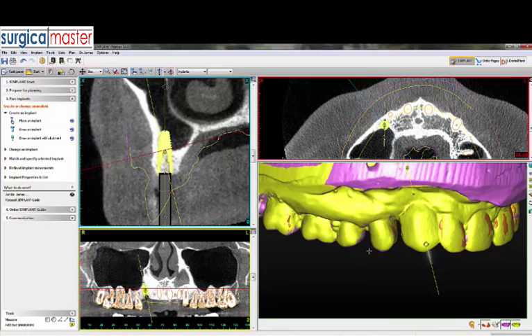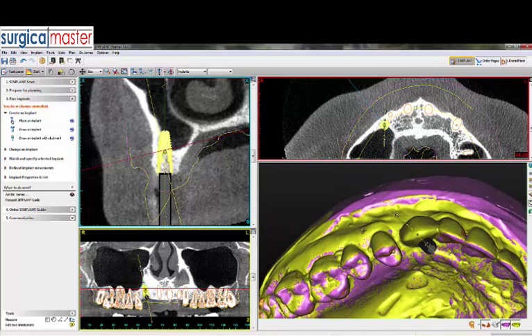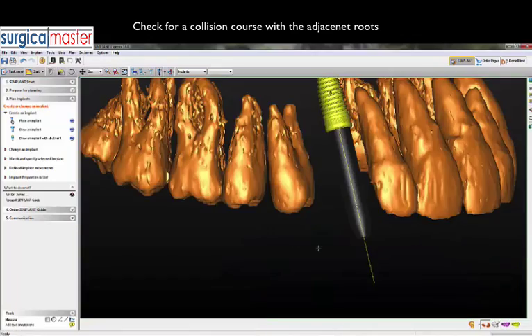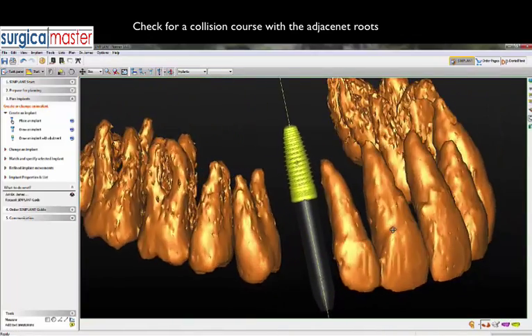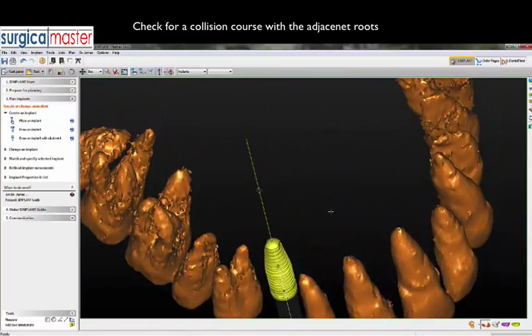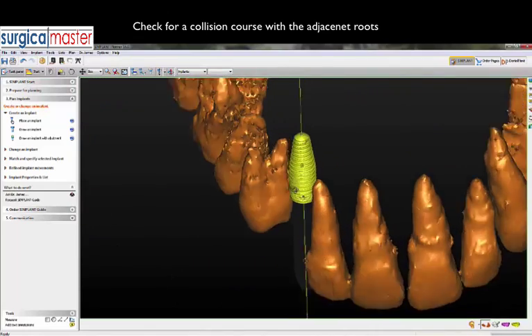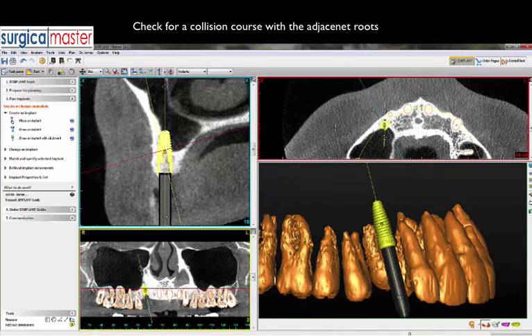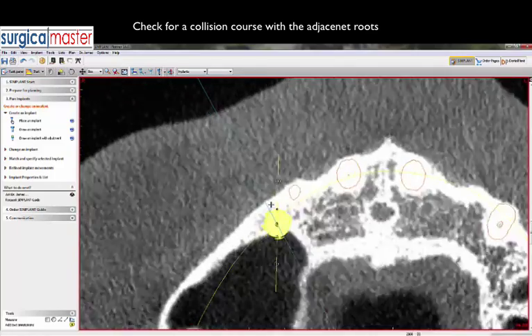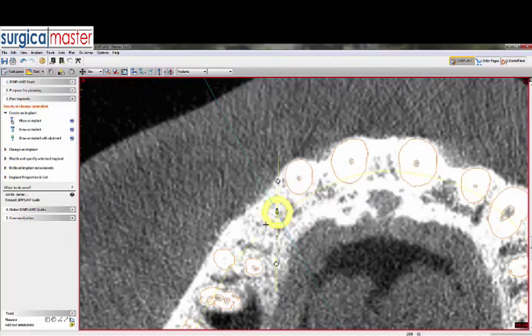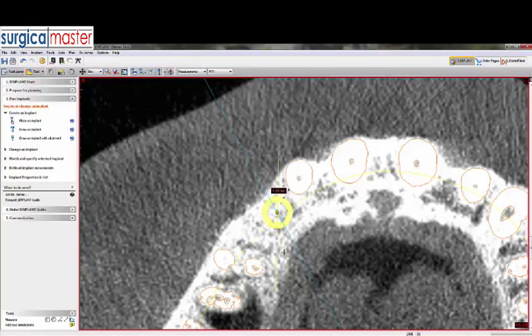A very important part of the planning process is to make sure we're not touching or getting dangerously close to adjacent roots. You can look at the 3D rendering from all sorts of directions and tell that there's a gap, but we can actually measure this gap in the axial view. I'll look at the axial view starting from the platform level and make a measurement to the adjacent lateral incisor. We are actually very close — less than 1.5 millimeters.